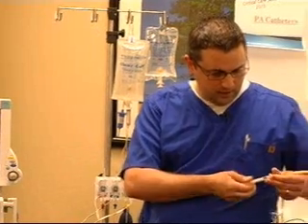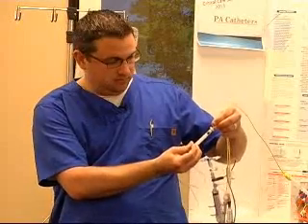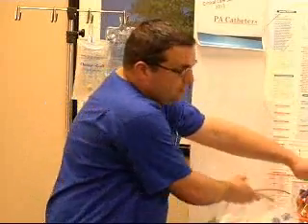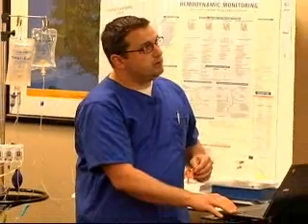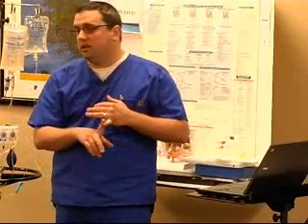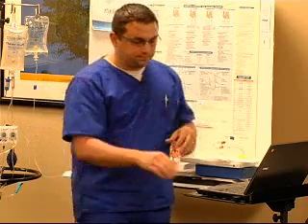Okay? And again, I'm leaving this connected with the gate open and the syringe depressed, so that way if there was air trapped in there, it would go through. Okay? There's also another example here that talks about your respiratory effects at your end expiration. That's the other thing that's important when you're doing your injection for your cardiac output, is to make sure that the time frame when you're injecting it is at end expiration, so that the most neutral time frame for the thoracic cavity is what you're looking for. Okay?